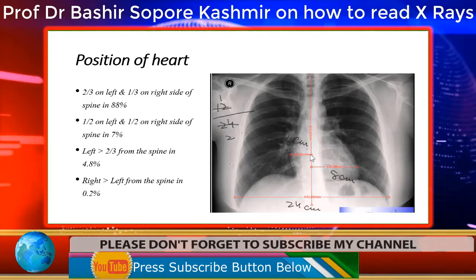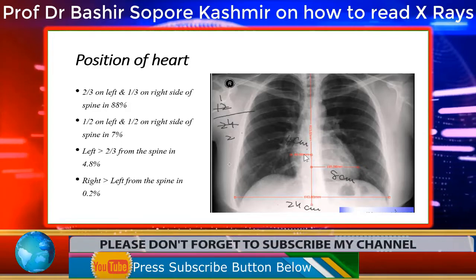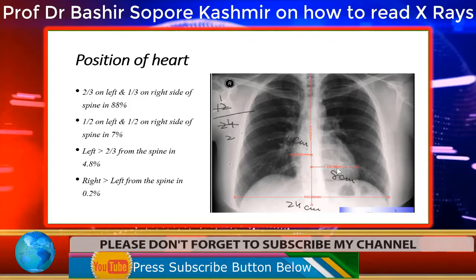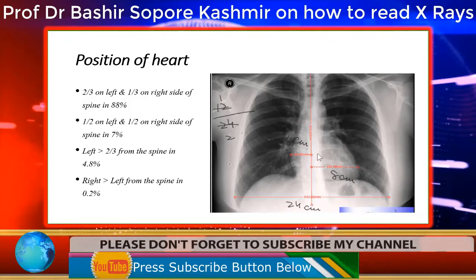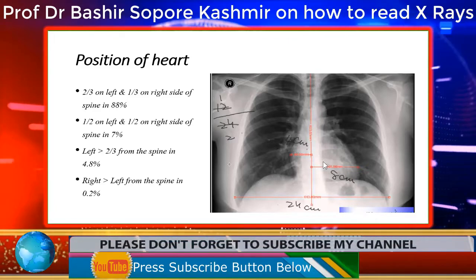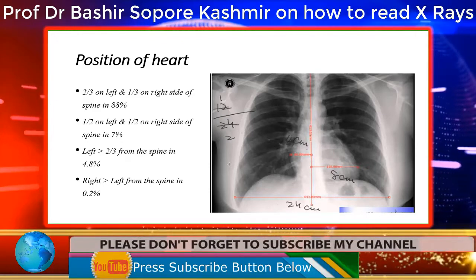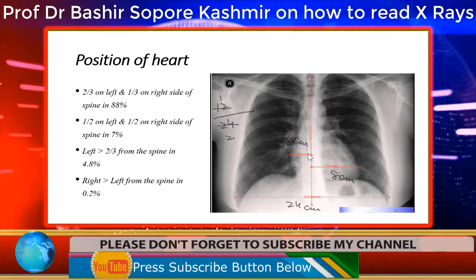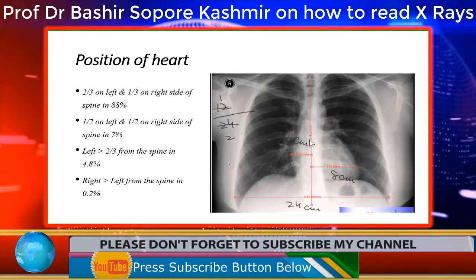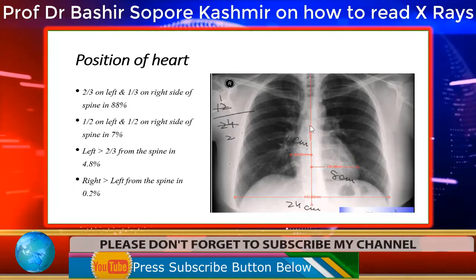Or sometimes the right side is greater than the left from the spine, then we see it only in 0.2% of the cases. But for practical purposes, and usually and often, we see that the heart is two-thirds on the left side and one-third on the right side. So I have shown you here the measurement by which we can calculate cardiothoracic ratio.